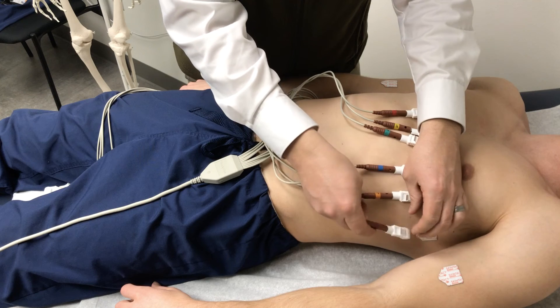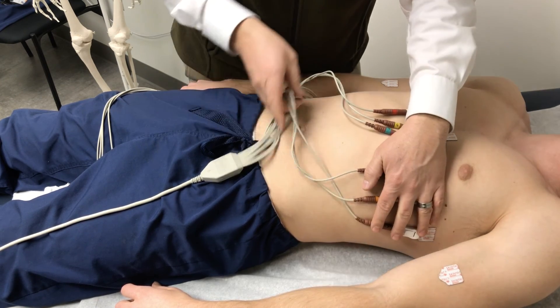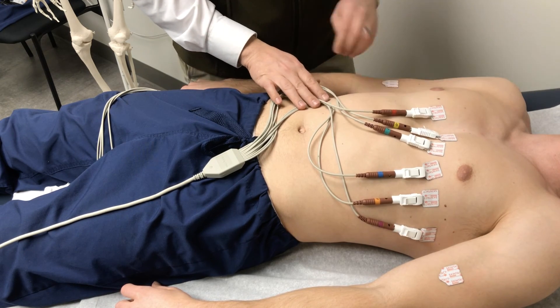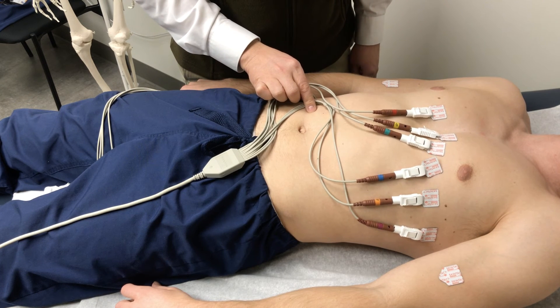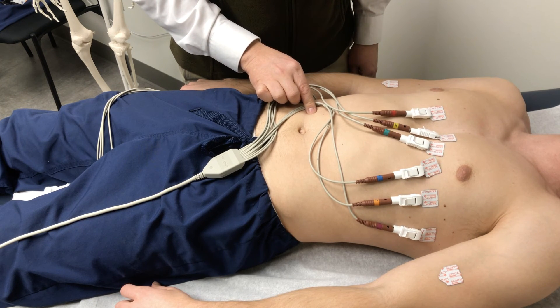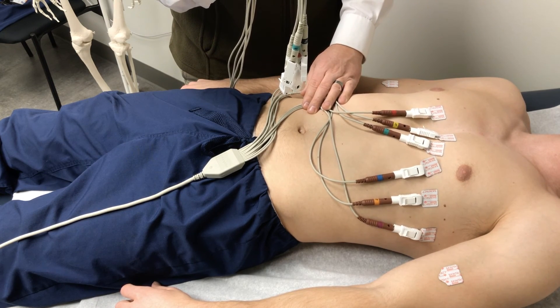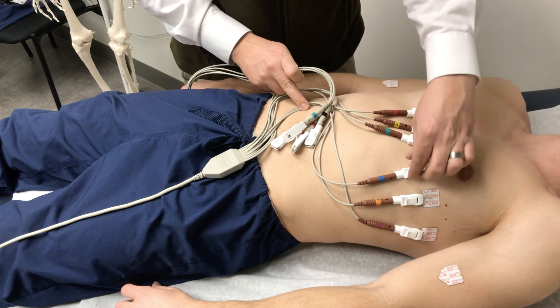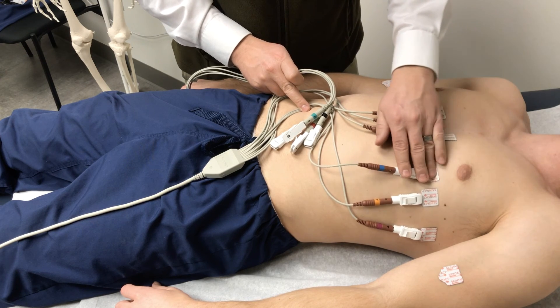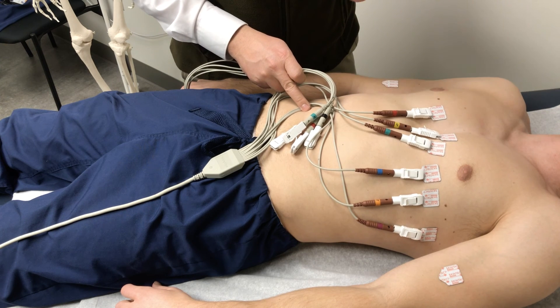Go ahead and do V5, then clip on V6 as well. Sometimes it might require some tape to help hold everything in place on the patient's skin while it records the EKG. You would do the exact same thing with your limb leads — right arm to right arm, left arm to left arm, and same with the lower extremities clipping onto those electrodes. Once you've got it all hooked up, stand back from your patient, have them breathe normally and hold nice and still while you hit record, and it'll print off your 12-lead EKG or a rhythm strip depending on what you're trying to record.